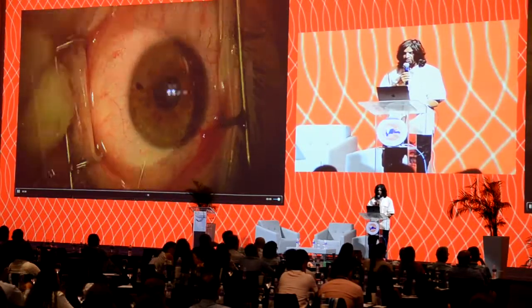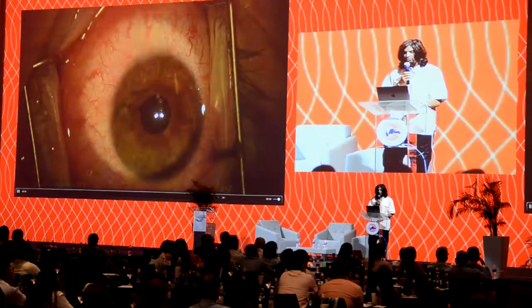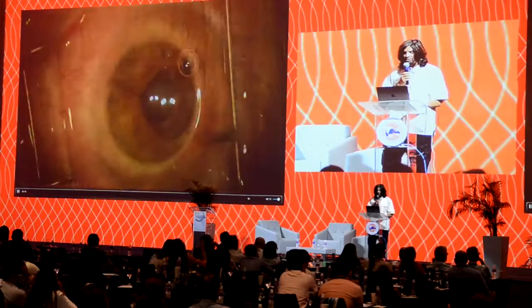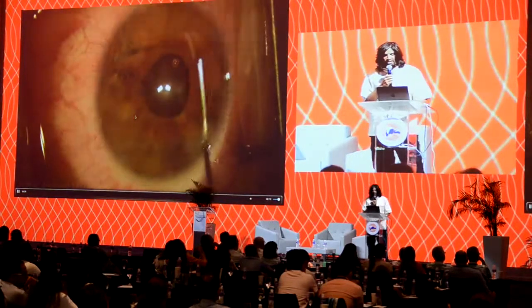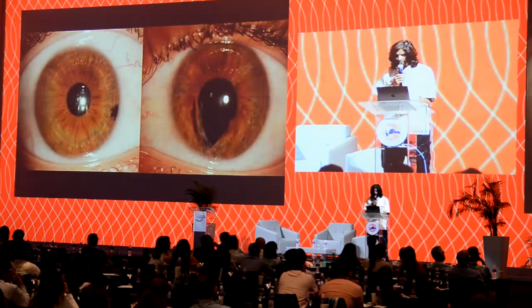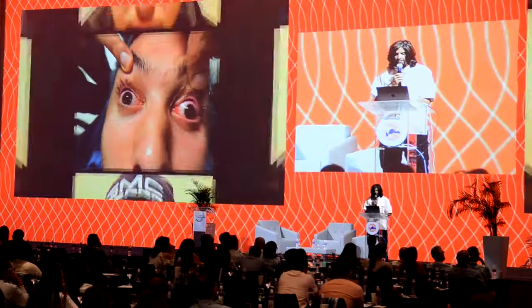So I'll just forward this here just to show again, and we have to often place multiple sutures to do that, and be obsessive a bit. I didn't like the notch there, so I put an extra suture in there. Didn't need cautery here, but sometimes we do use cautery as we showed. And there's the pre-op, there's a post-op. This is immediately post-op. This is a few weeks later. You can see his appearance.